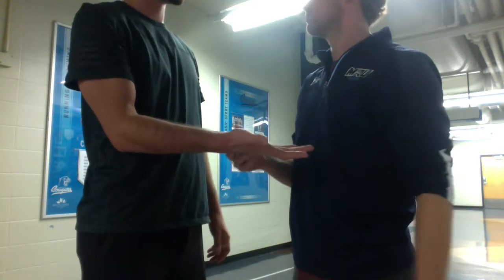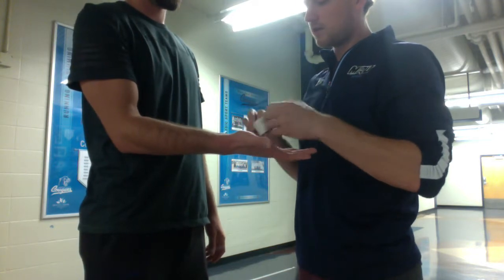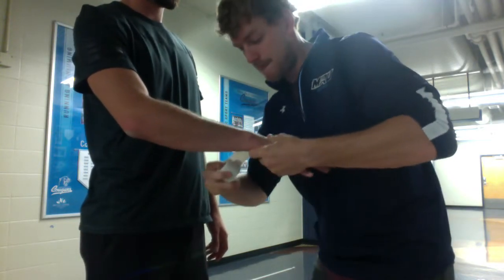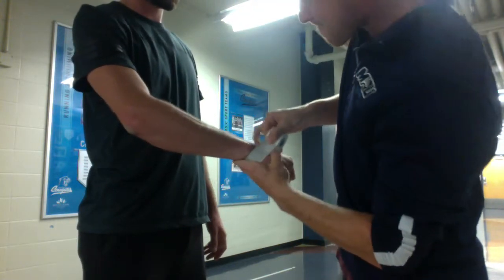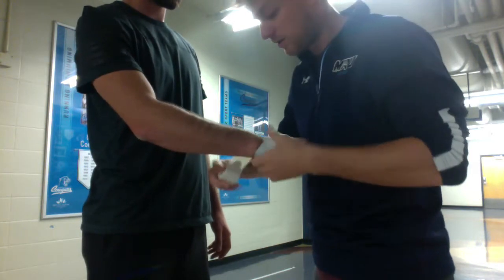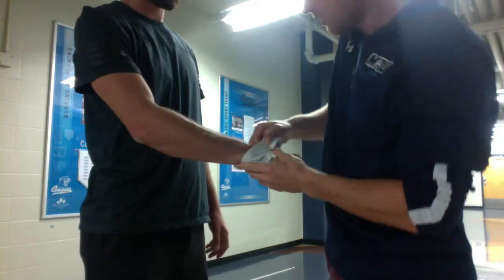All right, we're just going to tape your hand up just to protect and prevent the area from getting injured when you're playing. So what we're going to do is we're just going to tape around the wrist here. Actually, I'll get you with your palm down for me. Make a fist for me, because that's what you'll be doing when you're playing. So this is just going to limit all ranges of motion, but should still allow you to have that range of motion that you need to play. Sounds good.